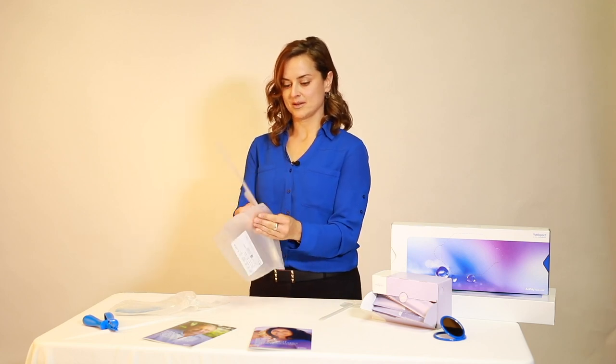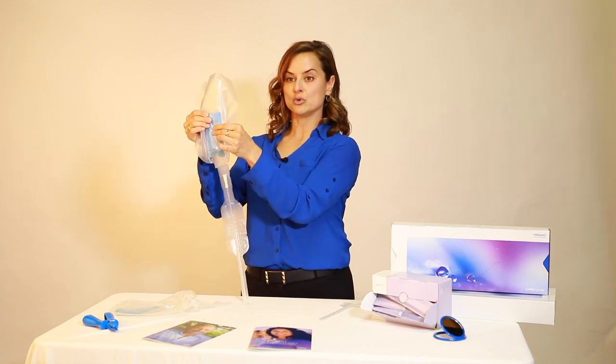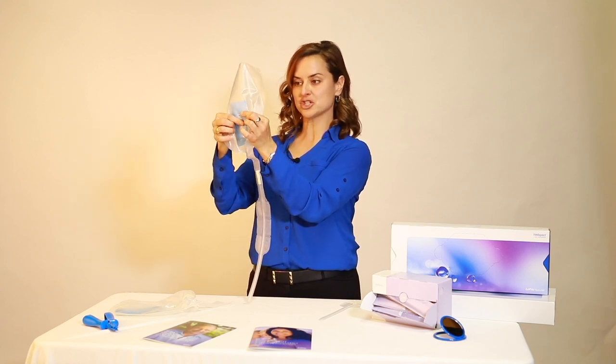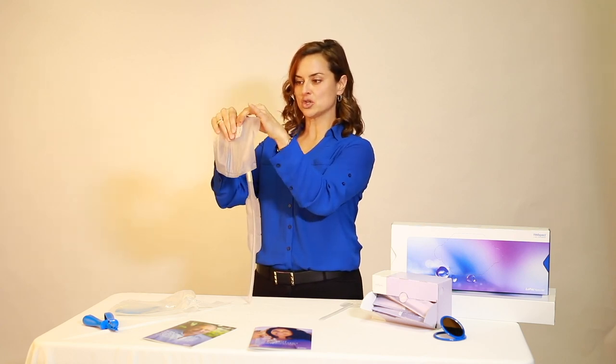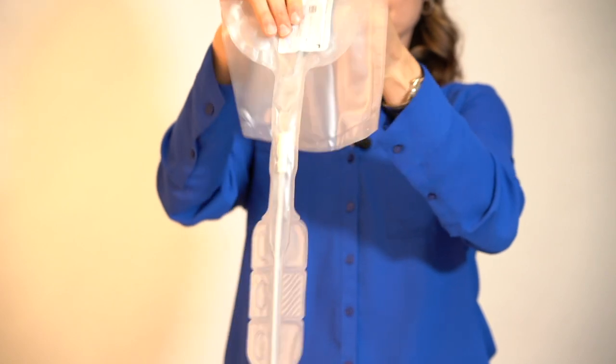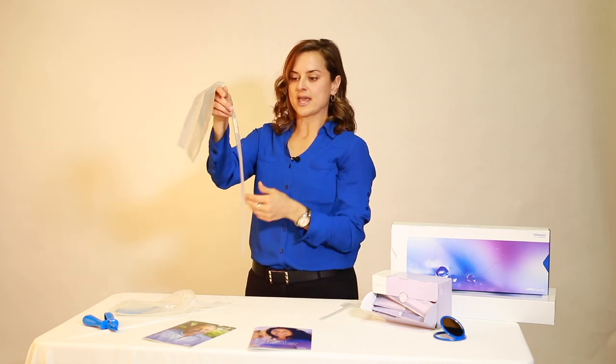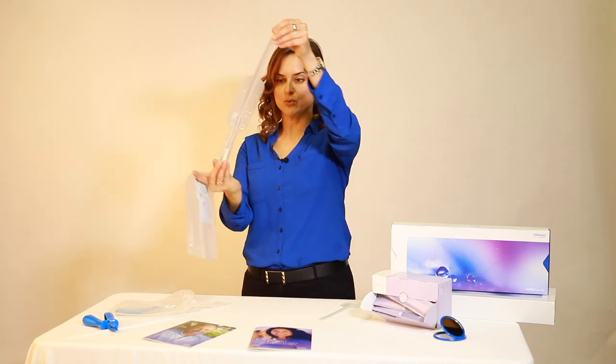I'm going to demonstrate this one more time. Again, we have Lofric HydroKit with instant activation. Lofric HydroKit is lubricated by releasing the salt solution sachet. Move the water to the bottom half of the sachet and then fold the package over. Push down with your thumbs — and if it's easier, you can also use the heels of your hands. The catheter is fully lubricated and coated with the salt solution.